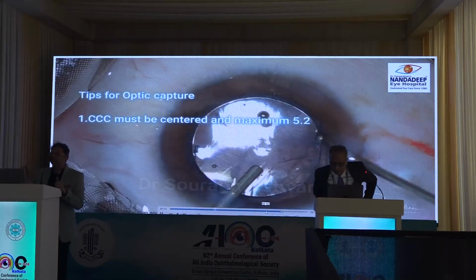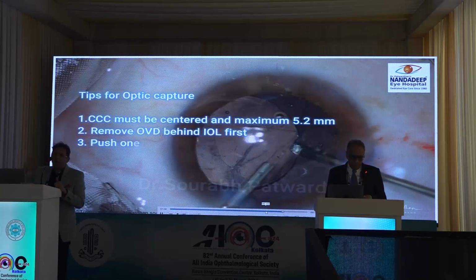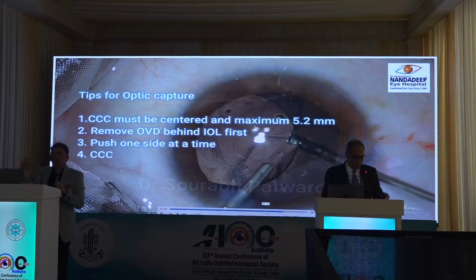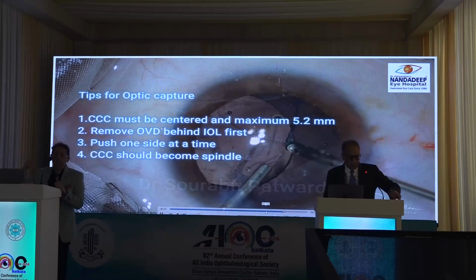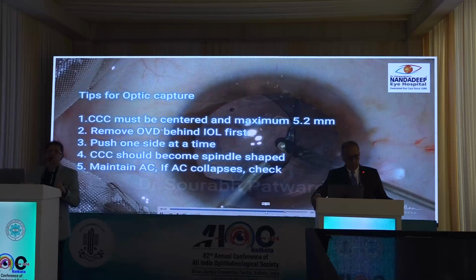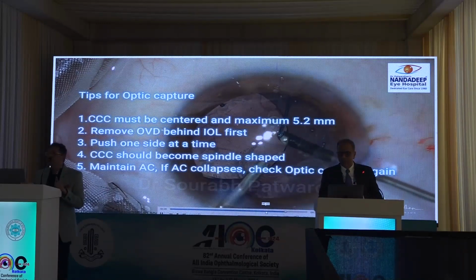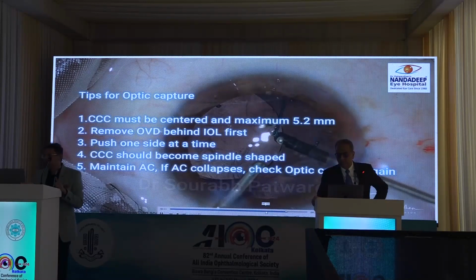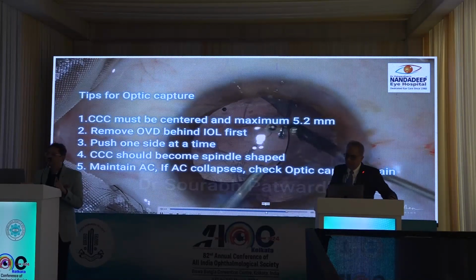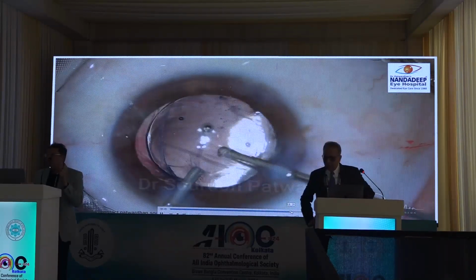The next tip is when the CCC is centered and you want to tap, remove the OVD, if there is a vitreous behind the IOL, first before you do the optic capture, because once you do optic capture, whatever OVD is trapped behind is going to stay there and may give rise to a little bit of raised IOP or inflammation post-operatively. So if possible, you remove this OVD behind the IOL first if you are comfortable with that. The end point of optic capture is to have a spindle shape configuration.